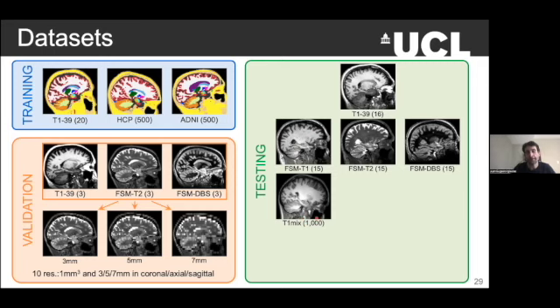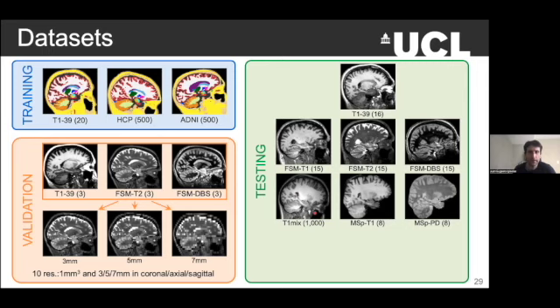So this was, I don't know how many years ago, but our former coworker Mert Sabuncu downloaded like every single T1 dataset that he found on the internet and combined them into like a zillion scans and processed them with FreeSurfer. So we took 1,000 of those, should be enough. We also have this small dataset, it's only 8 scans, but it's useful because it's multispectral. So we have a T1, but also proton density scans.